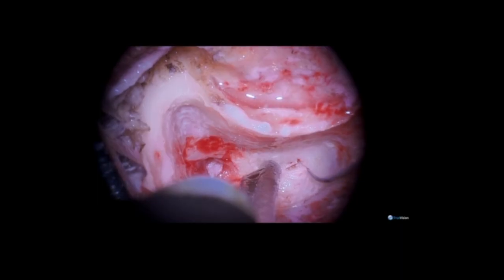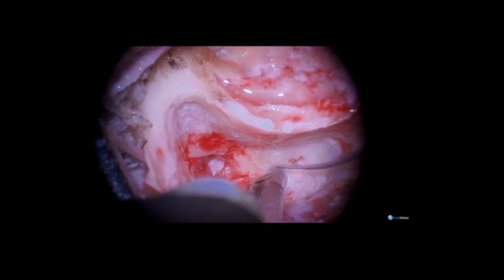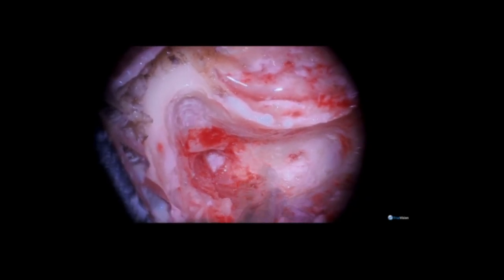Here you can see the beginning of the facial recess air cells and the facial nerve identified.